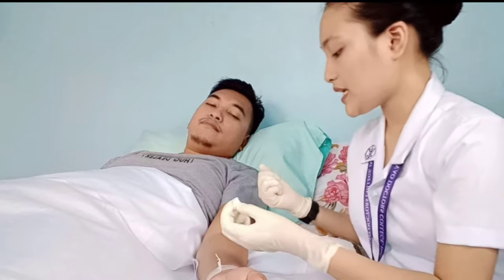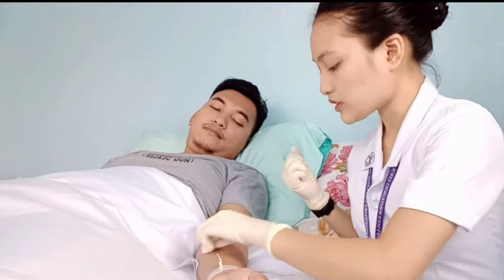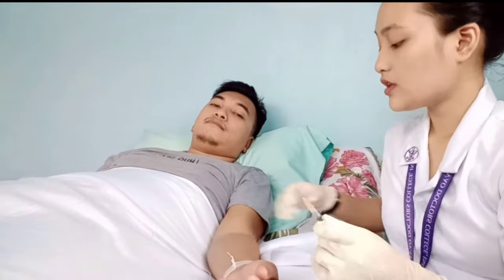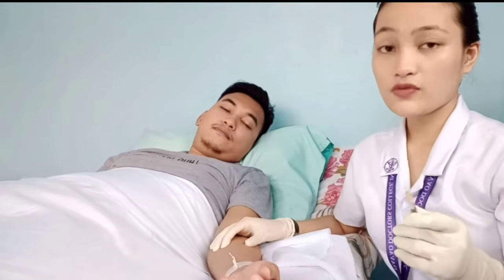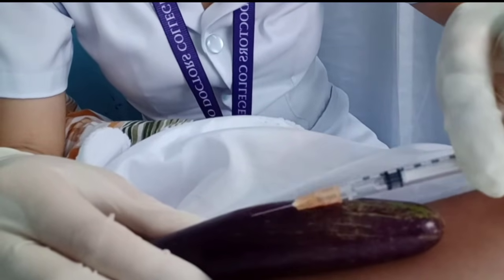Now use an antiseptic swab to clean the site, beginning at the center, circling outward about 5 centimeters. Now remove the cap and hold the syringe between the thumb and the forefinger with the bevel of the needle pointing up. Stretch the skin taut by gently pulling with the thumb and the forefinger of the non-dominant hand. Okay, pull the needle very close to the patient's skin.